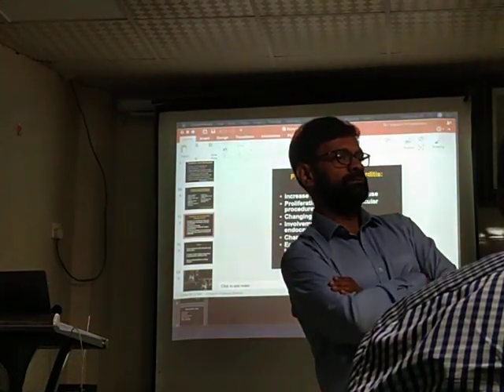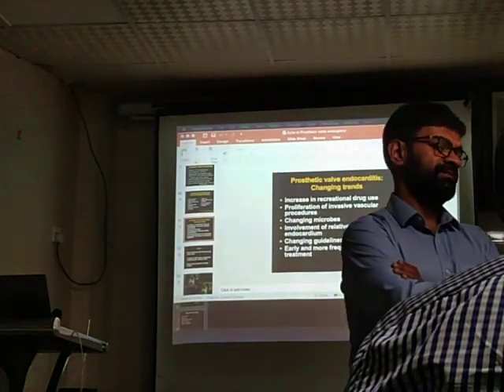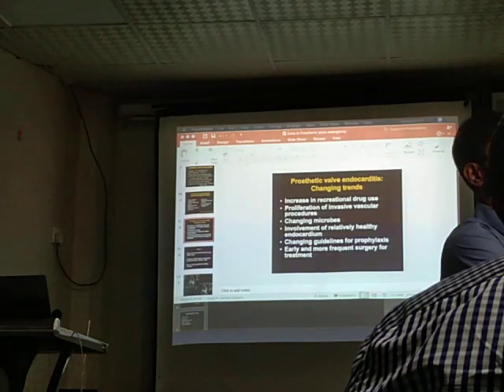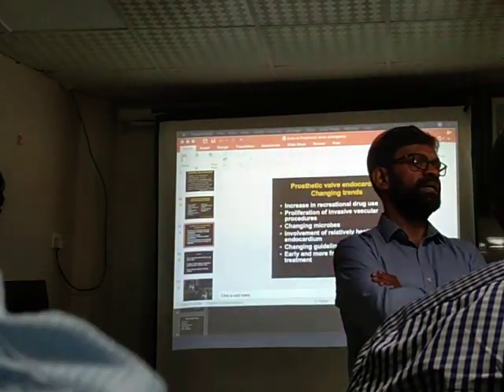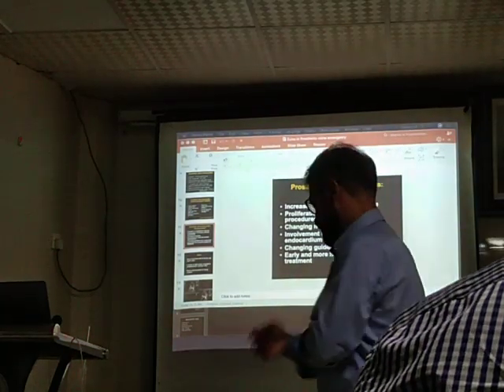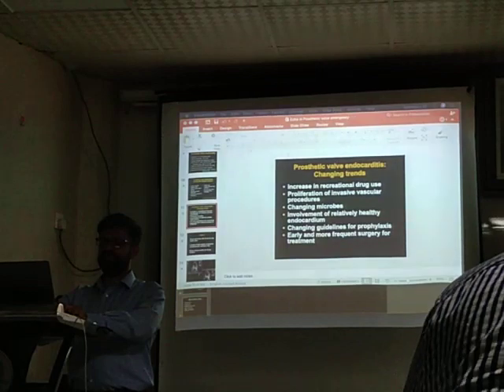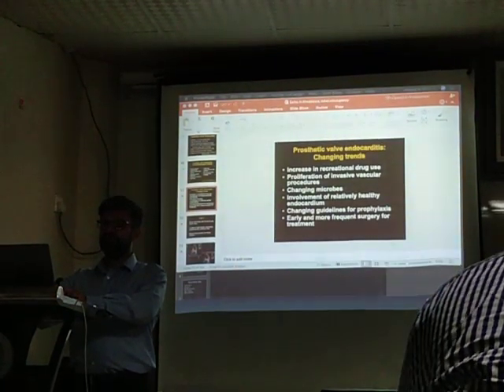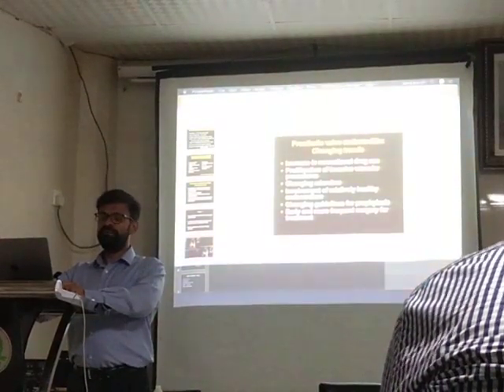And you also asked about regurgitation. Prosthetic valve regurgitation, mild or trivial, is acceptable. But if you are seeing a paravalvular regurgitation, it's significant. But how much would you grade? The leak is severe. The patient had a leak. Transvalvular or paravalvular? Gradient is mild.